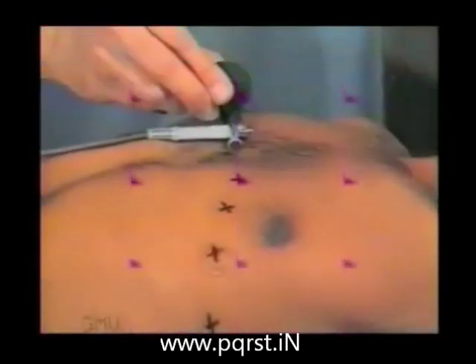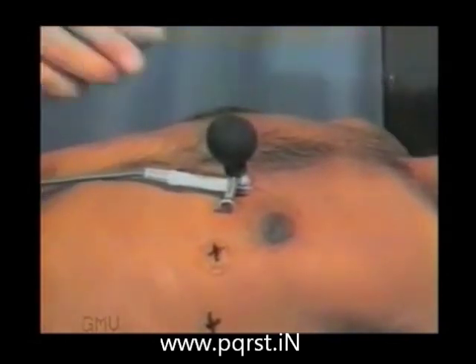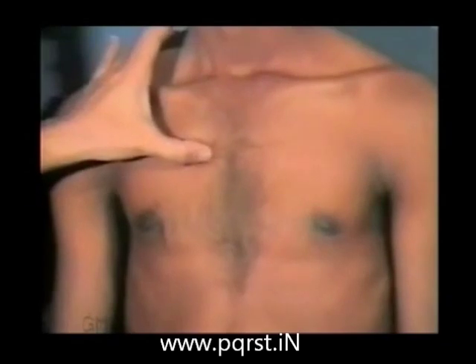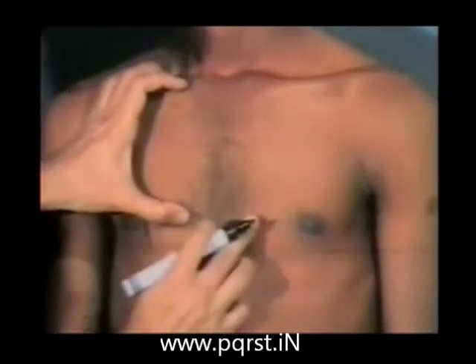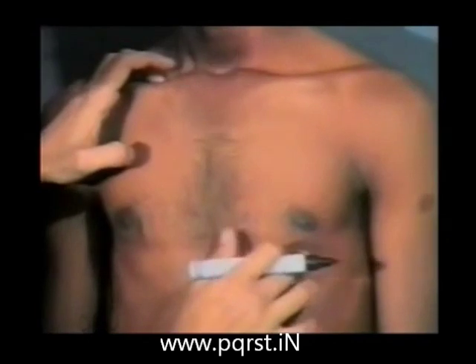The chest leads are recorded with an exploring electrode placed at various points over the chest, while all the 3 limb electrodes are connected together to form the neutral electrode. The points are marked as follows. Palpate the sternal angle. The space just below the sternal angle is the second intercostal space. Mark the fourth intercostal space at right sternal border as V1. Then mark at the same level, that is in the fourth intercostal space at the left sternal border as V2.